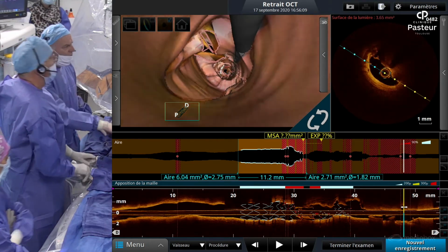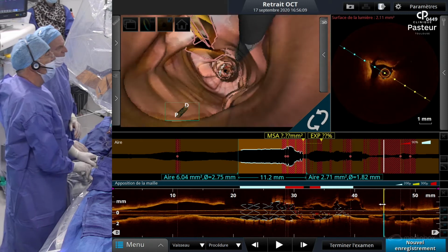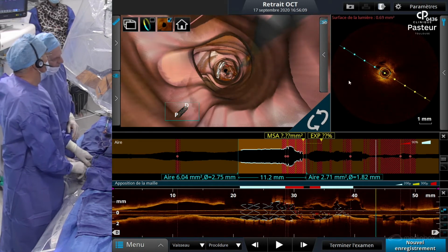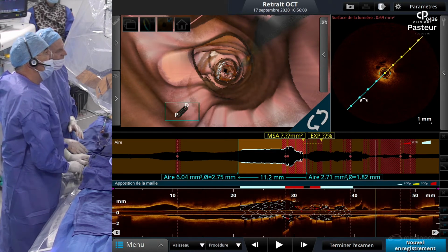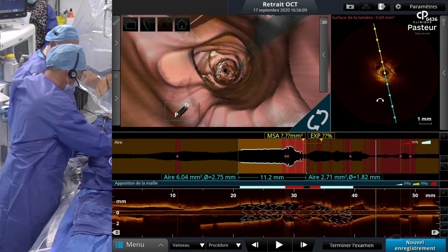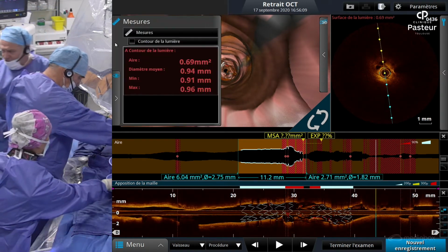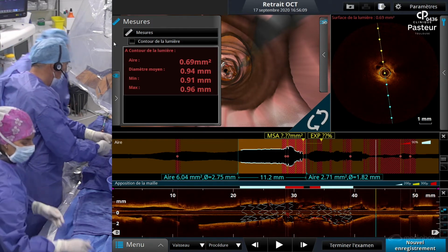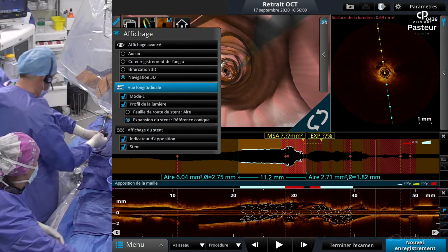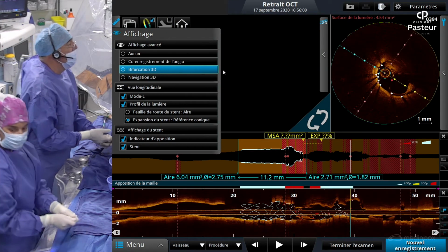Okay. So, free row, and now look at the size of the LAD. Just to look at the size of the LAD, we can move on. There was a question, sorry, because we were focusing on the image of the OCT. And okay, I will read the question.